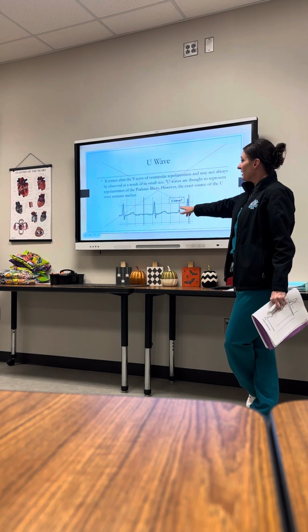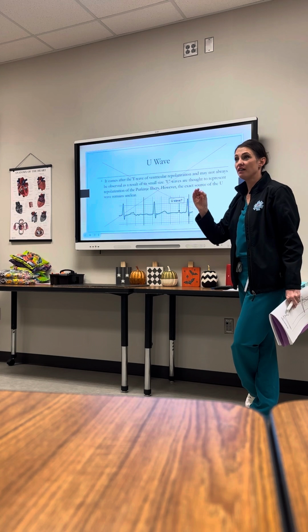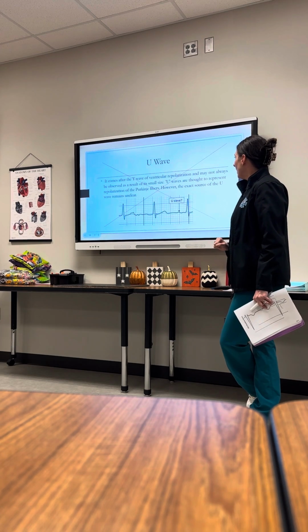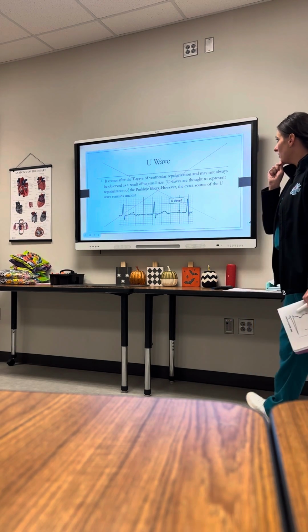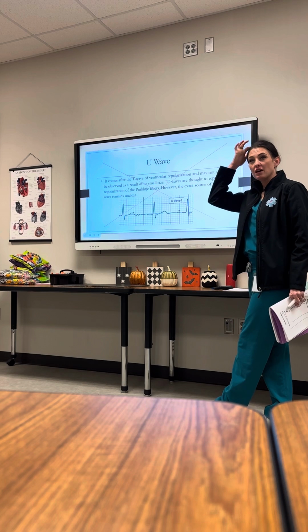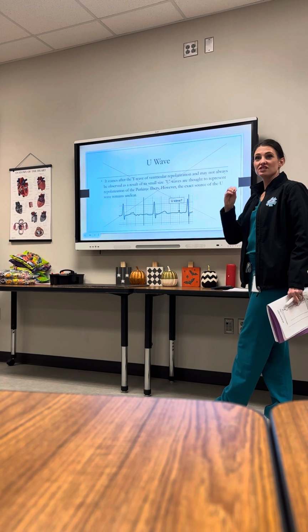It is going to come after the T wave, and it's thought to be the repolarization of the Purkinje fibers to some. It's a debatable topic, okay? Thought to be. U waves are thought to represent the repolarization of Purkinje fibers. However, the exact source of the U wave remains unclear, okay? You've heard about it. You don't have to lock in a ton of information on it. Just, we've talked about it.